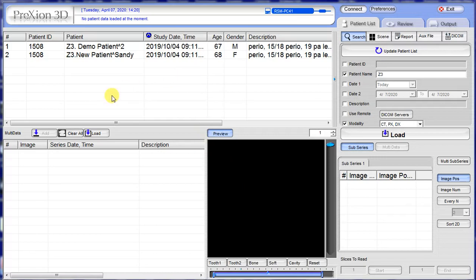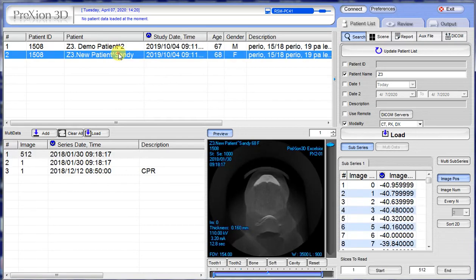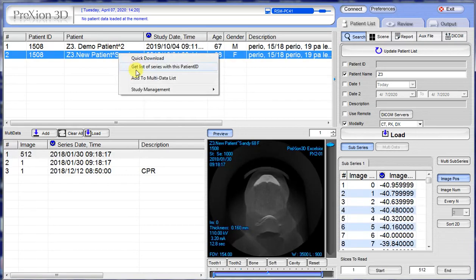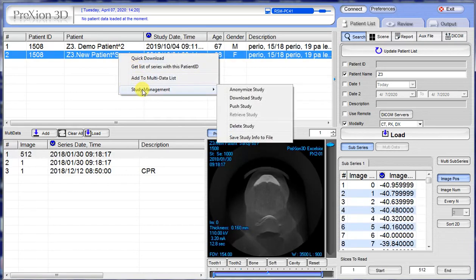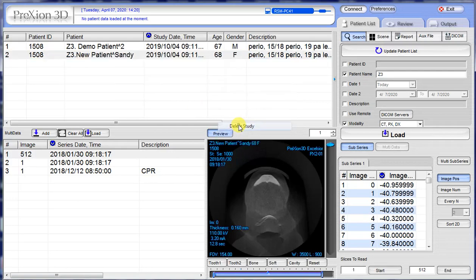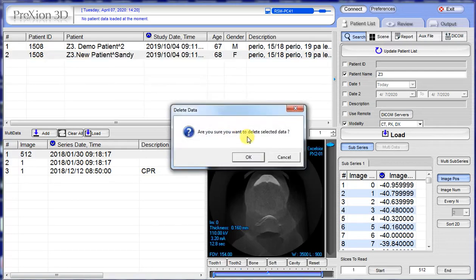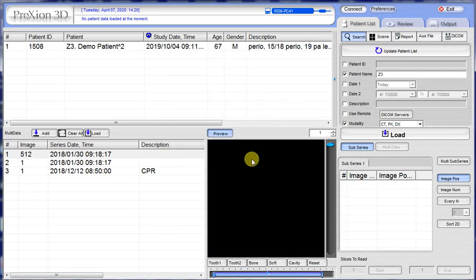Now to remove the first incorrect study — to delete it. In this case I'll just delete the second one. Highlight it once, right-click, go to Study Management, go to Delete Study. It's going to ask if you want to delete it. Click OK and it deletes.